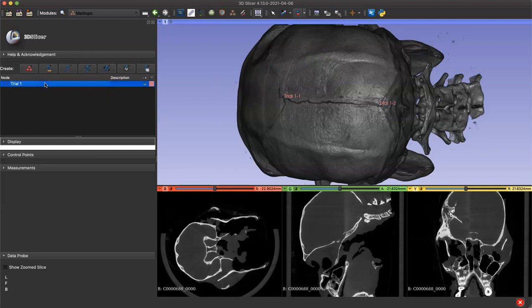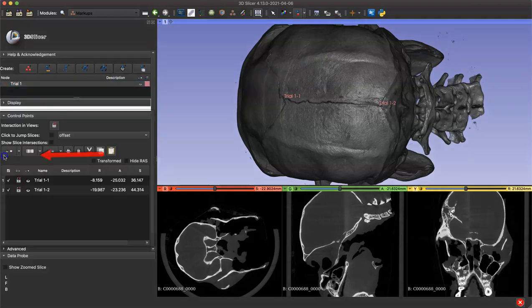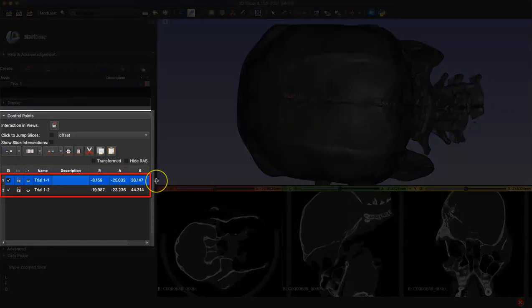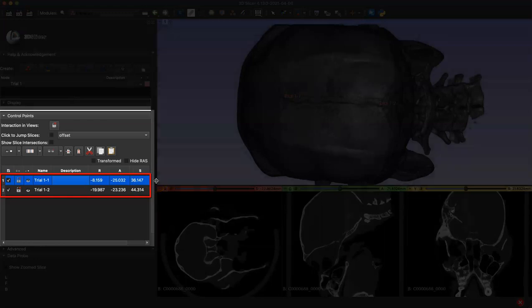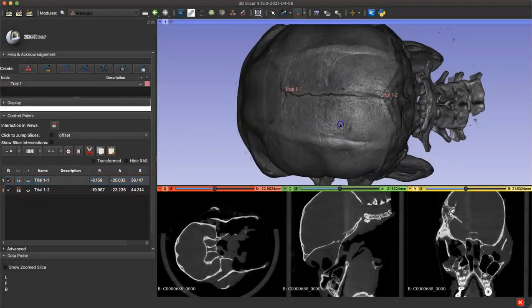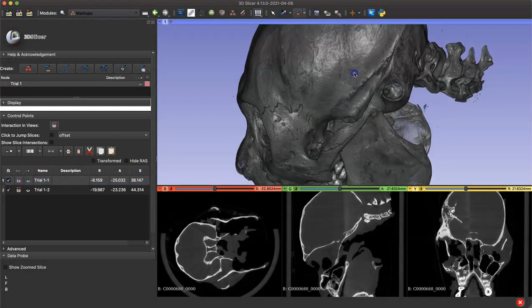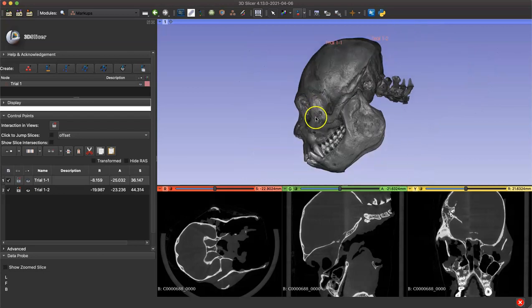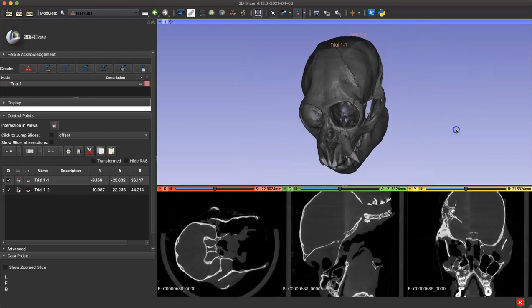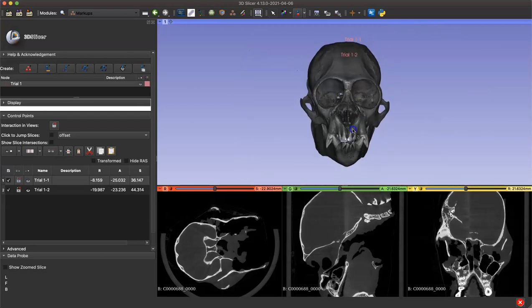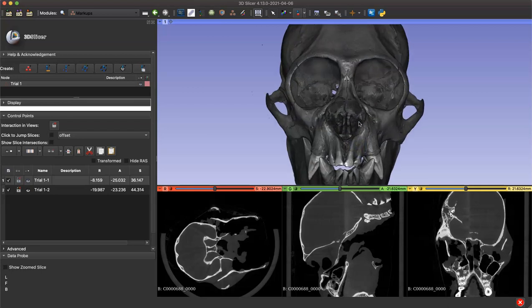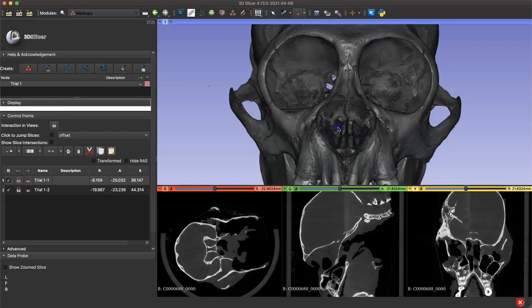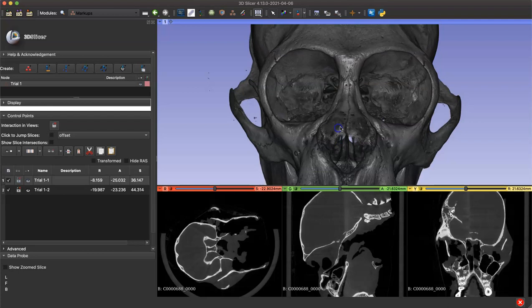Now in our left side menu we can see the node we created, and if we open the control points drop down menu we can see the landmarks we just took and the XYZ coordinates for each of these points. Since we exited from persistent mode, we can now click our model and move it without taking points. I'm going to move the model to a different area of the skull, arrange it in the way that's best for taking our next points, and then click back into our persistent fiducial mode.